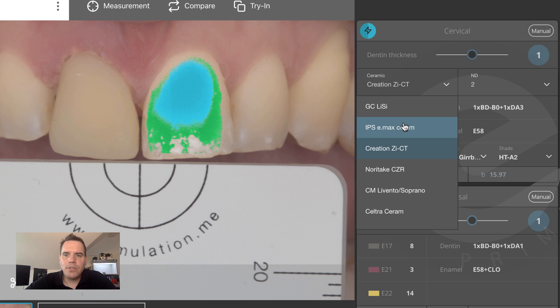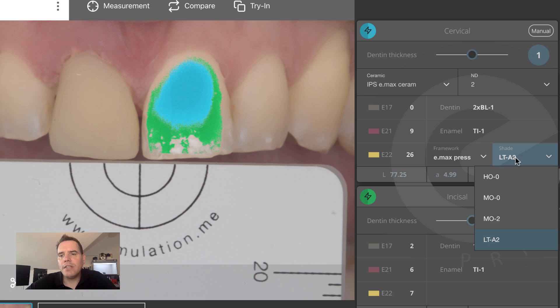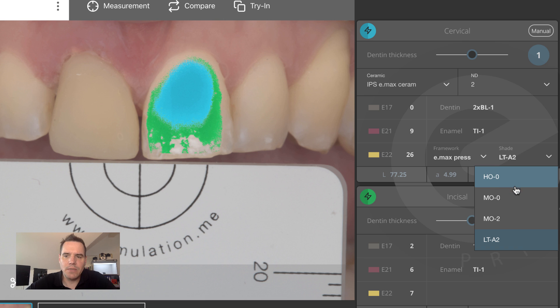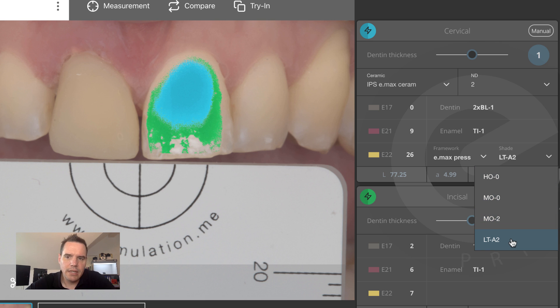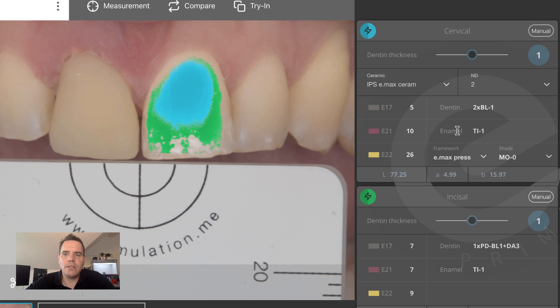Let's go back to selecting IPS e.max Ceram, which is one of the most popular ceramic systems being used in Prime. What you can do is combine your experience and your intuitive perception with this mathematical process by having the choice of selecting different framework materials for a given case. So in this case, for instance, you could copy this color on four different framework materials out of the six that we support. If you didn't want to do this with LT A2, perhaps because you're concerned about some mild discoloration, you could just choose MO0 instead and the mixing recipe will be adjusted accordingly.